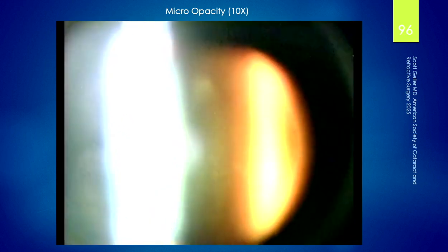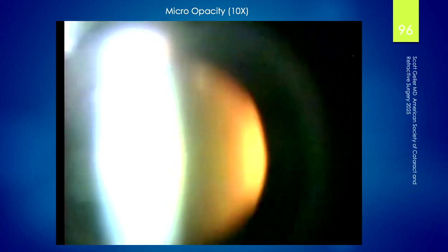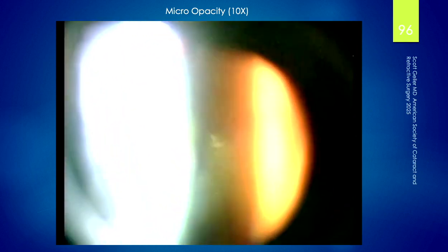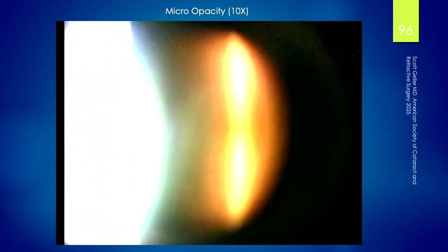But you have to take your time. Don't rush things. If you think this is going to be like a capsulotomy, it most definitely is not. Take your time. Don't rush. And devote the thought process you need to get the job done.